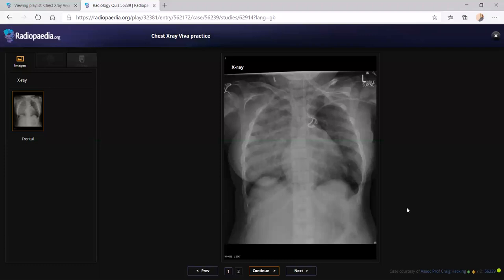Okay. There is an NG tube also that I told. So the rib pattern suggests some underlying skeletal deformity, along with an element of cardiomegaly, and patchy opacities in the right lung. Going by all these features, I'm thinking of some developmental condition with a cardiac element along with a skeletal deformity. So maybe Ellis-van Creveld syndrome or some developmental condition. Other than that, I suggest an echocardiography for the patient.